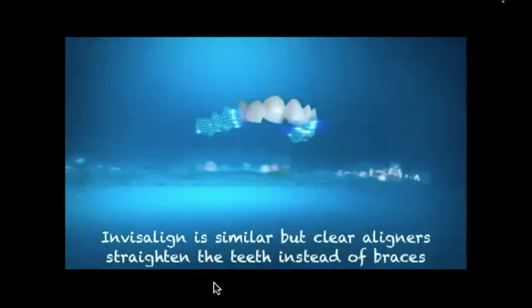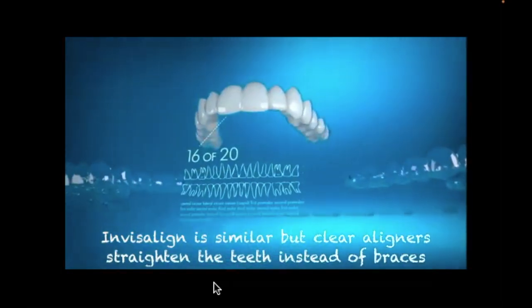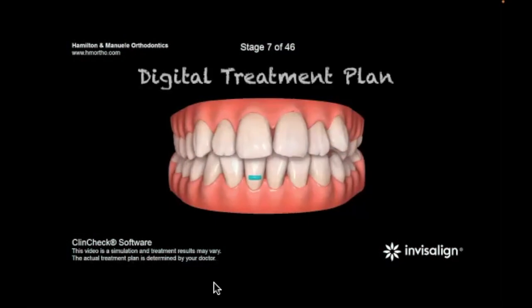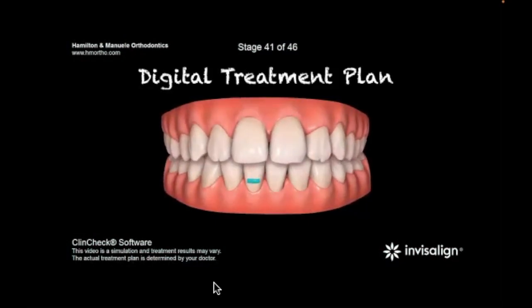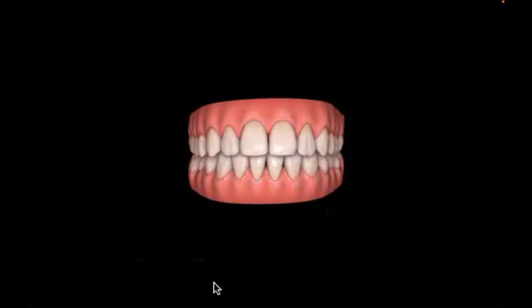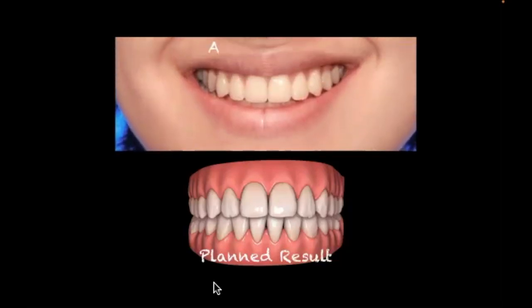But pretty accurate. You guys are all familiar with clear aligners as well. There's over 100 clear aligner companies now. Obviously Invisalign was the only major player in the game for a long time, but a lot of the newer companies have a ton of innovation and even more than innovation, customization. You can customize things like you've never been able to before, so the times we can treat with clear aligners have gone way down. The cases we can treat have gone way up as far as what we can do with them.